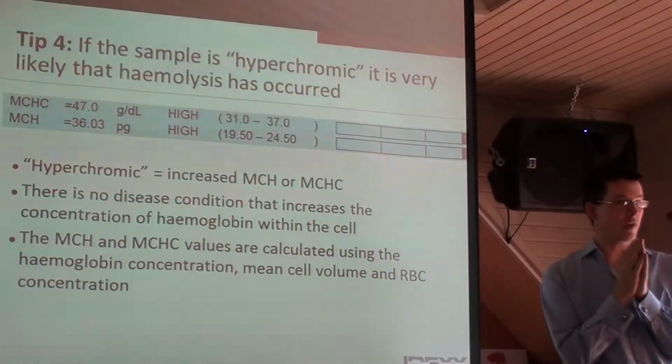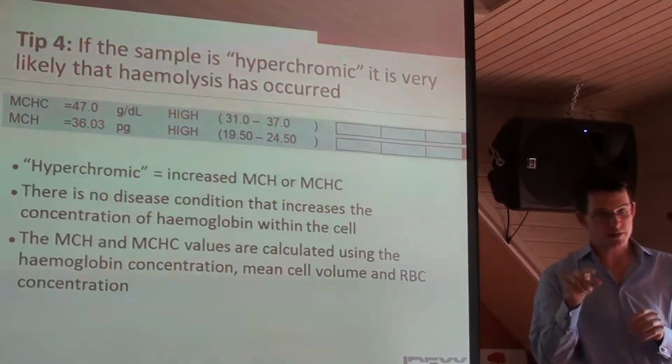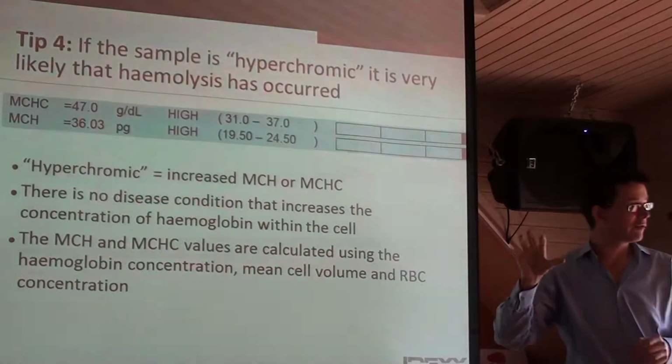But it doesn't know whether hemoglobin is inside red blood cells or if it's free in the plasma.